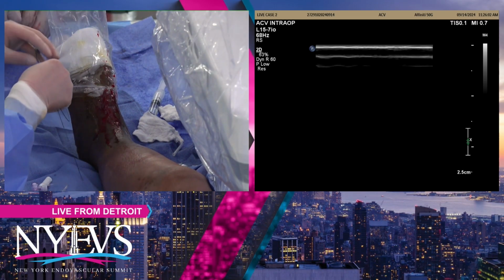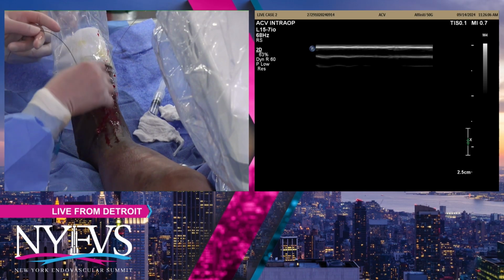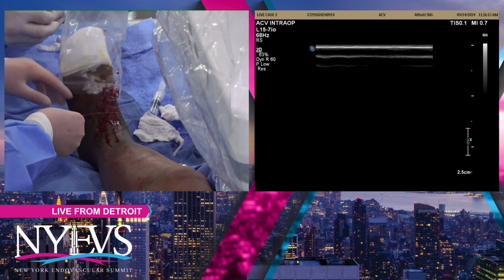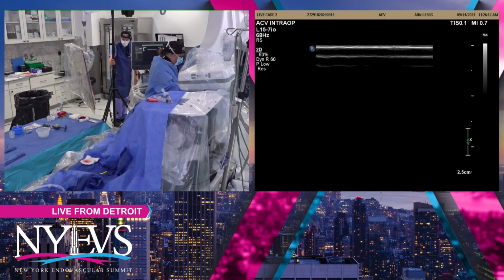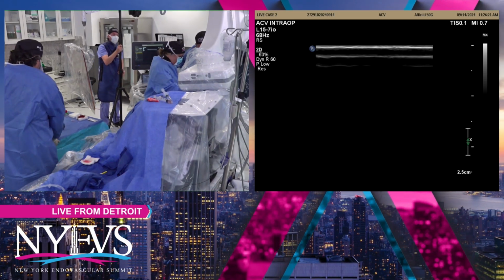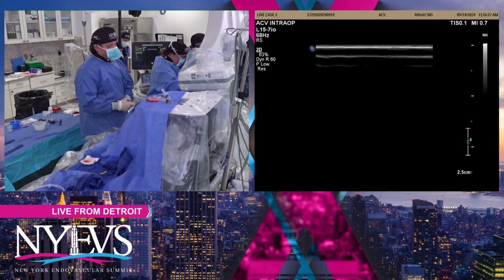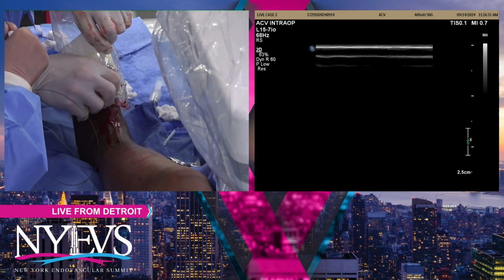So Fadi, that was a great demonstration. It's Lawrence Garcia, but I've always found it hard to have two hands in there besides mine with ultrasound and support, because I can always change the angle. But that was really remarkable tandem work that obviously demonstrates that in your lab, your ultrasound sonographer knows what you're doing with your needle, and that's really the interplay between operator and sonographer, very well demonstrated.